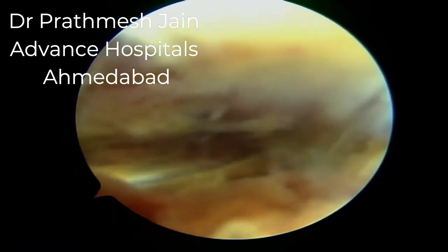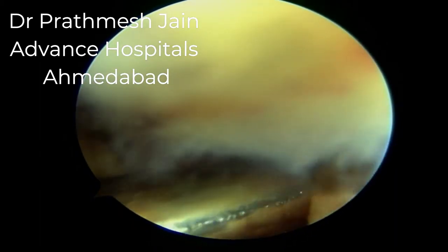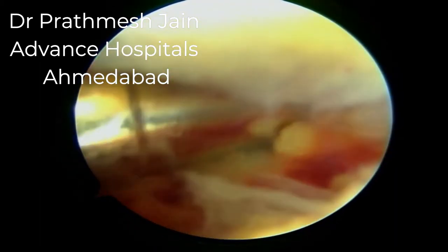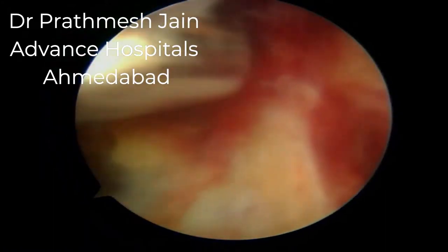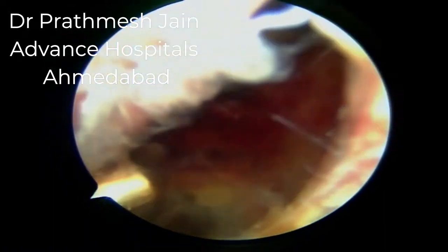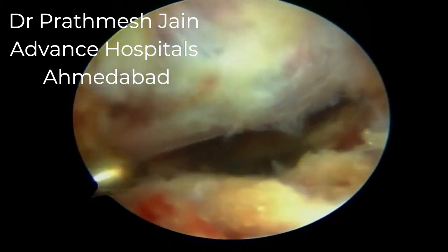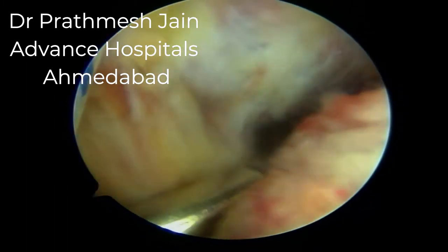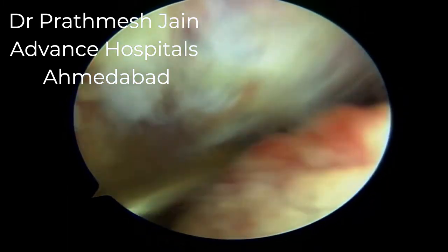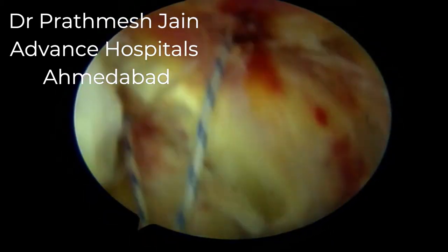We can also release part of the posterior intermuscular septum for a complete release, then focus attention on dissection more inferiorly. The shaver blade should be kept toward the bone, working on the bony side to prevent any vascular mishap. Here we can appreciate the nice bony fragment of the PCL avulsion as we dissect it thoroughly from medial to lateral.